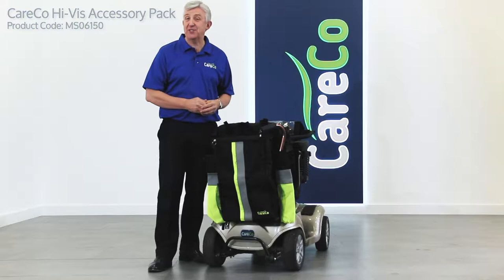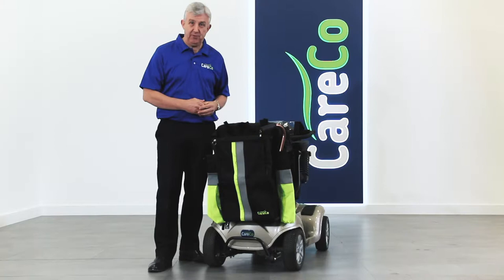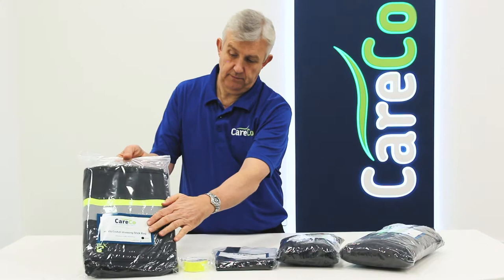This is the Careco Hi-Viz accessory pack — a collection of some of the very best mobility scooter accessories designed to keep you and your mobility scooter seen, as well as protected from the elements and other dangers of the road.